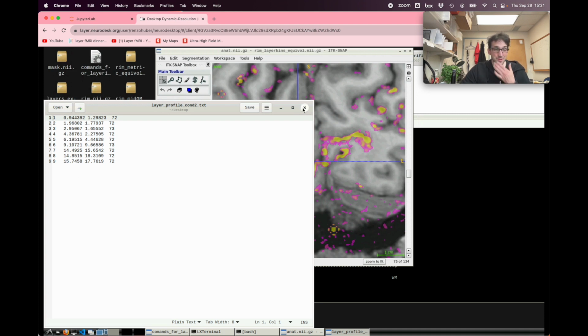Now, usually what we have here is these profiles for many different participants, and for example many different runs. And then we want to know, is one task condition statistically different than another task condition? What we care about is not only knowing if they are different, but if they are different in a way that they're not just scaled versions of each other.